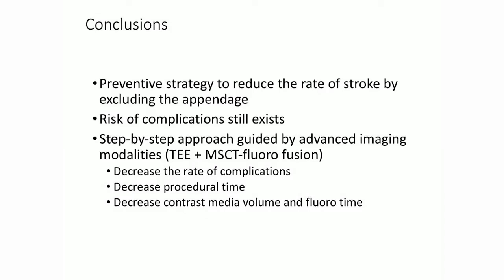So in conclusion, LAA closure is a preventive strategy to reduce the rate of stroke by excluding the appendage. Risks of complications still exist, and a step-by-step approach guided by advanced imaging modalities such as TEE and MSCT to fluorofusion can decrease the rate of complications, decrease procedural time, and decrease contrast media volume and fluoro time.